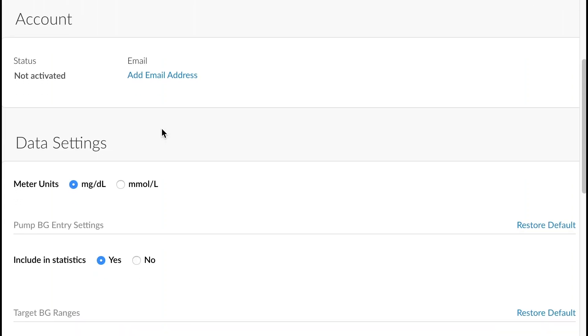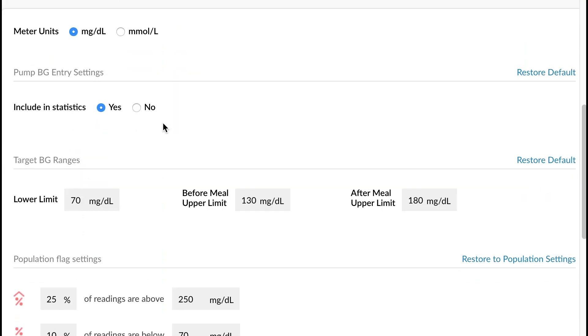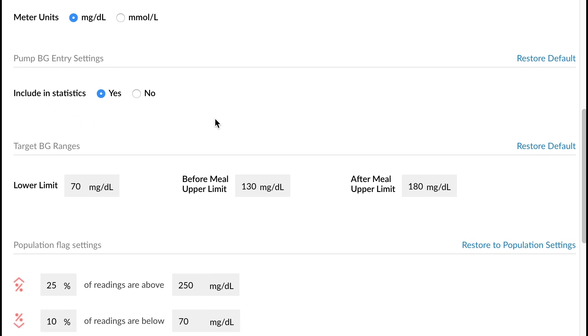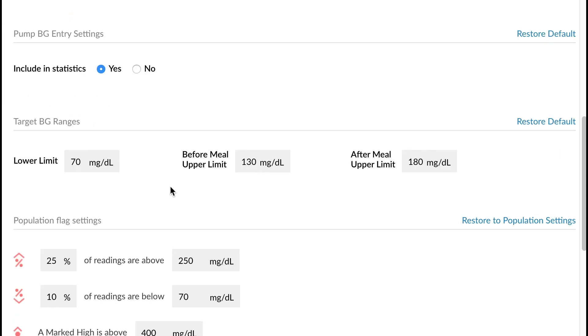If we scroll down to the data settings section here, it gives us the option to change the meter unit type. We can choose to include pump BG entries in these statistics. We can also modify the target BG ranges. So we can adjust the lower limit, the before meal upper limit, and the after meal upper limit.